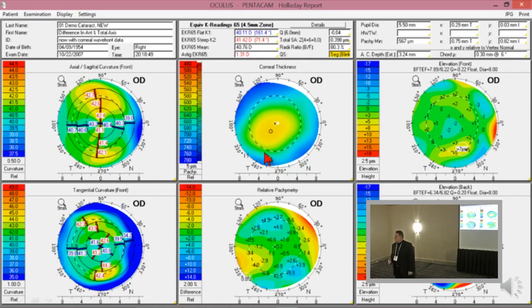But what they do sometimes is say, okay, now look, I want you to look at that target, and then the patient is still focusing, and by the time they get it in there, 3 to 5 seconds have gone by, and bam, they hit the button. That's a mistake because they've dried the patient's eye out. So you let the patient blink normally, and you actually tell them to blink, and then when you say, okay, stop blinking and stare, within half a second, you hit that button. But by putting drops into the eye, you eliminate the ability to see those broken lines. You won't pick that up. So it's not a good idea to put any drops in a person's eye when you're taking them.